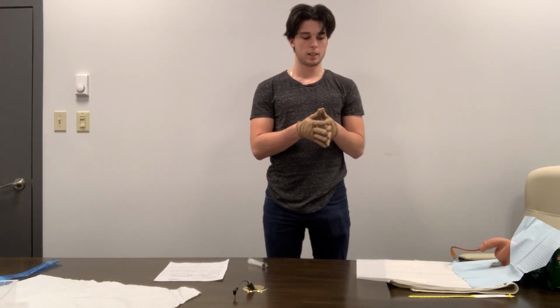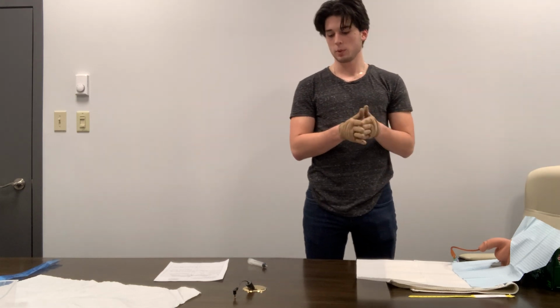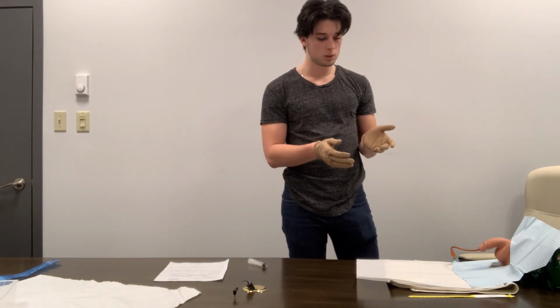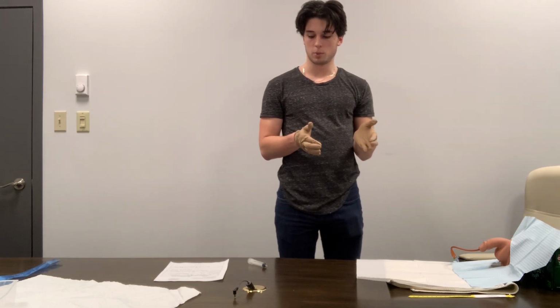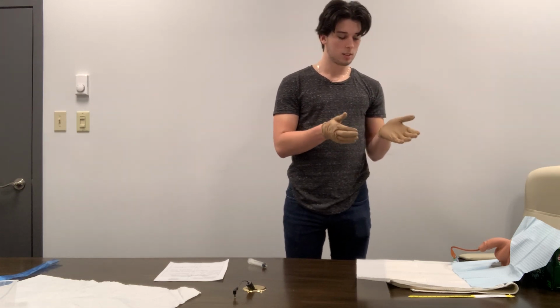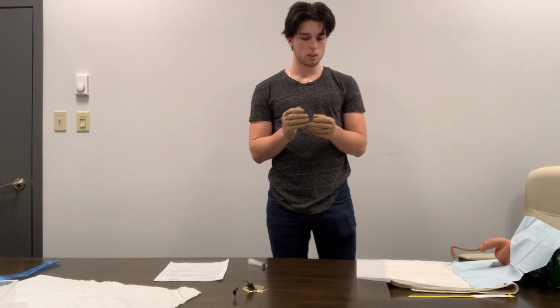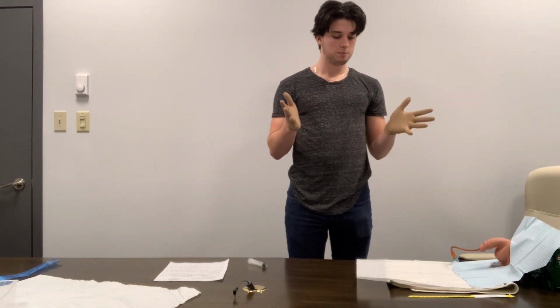We are going to explain that we'll be removing the catheter today because the physician no longer requires that we are monitoring their outputs very closely, so we can remove the catheter. They're going to tell us, yeah, we can go ahead with the procedure. Once we are good to go ahead, we're going to wash our hands, apply new clean gloves, and make sure that pericare is done.